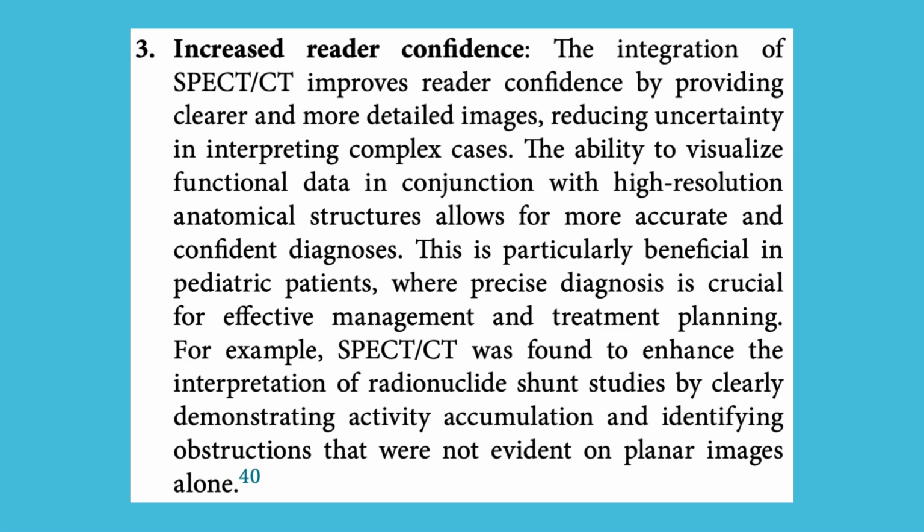3. Increased reader confidence. The integration of SPECT/CT improves reader confidence by providing clearer and more detailed images, reducing uncertainty in interpreting complex cases. The ability to visualize functional data in conjunction with high-resolution anatomical structures allows for more accurate and confident diagnoses. This is particularly beneficial in pediatric patients, where precise diagnosis is crucial for effective management and treatment planning.